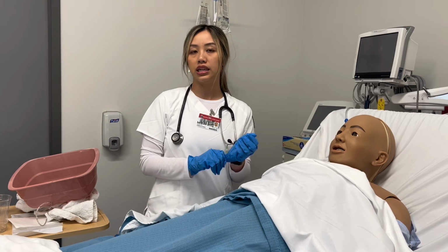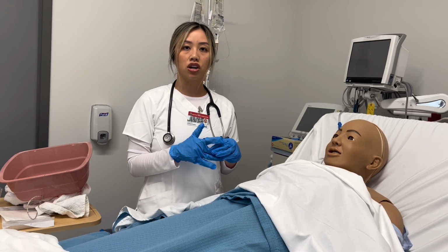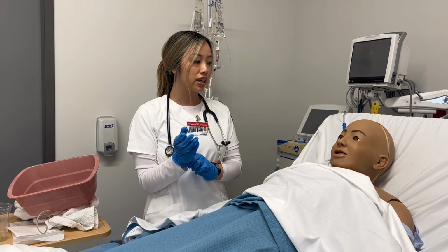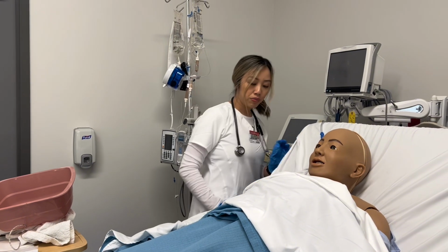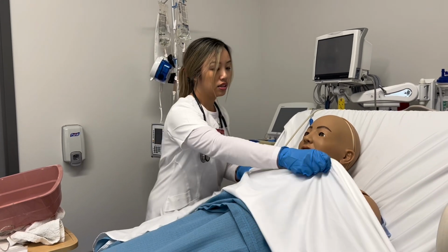So I'm documenting basically the tube, if there's any cracks or leaks in it. I would document the date and time. I would document the color, who removed it, how the patient tolerated it as well. And then I would put the call light here. So here's your call light. Here you go.